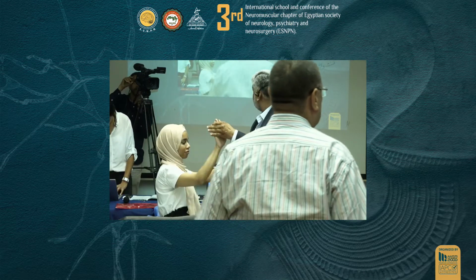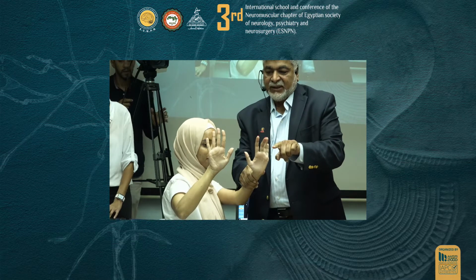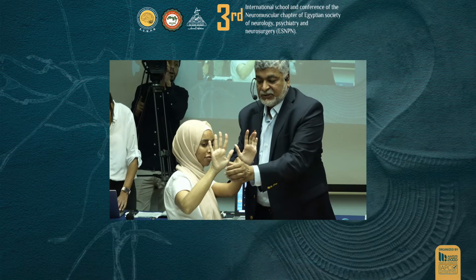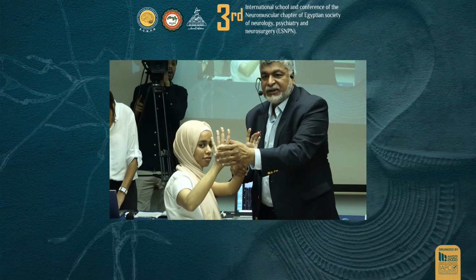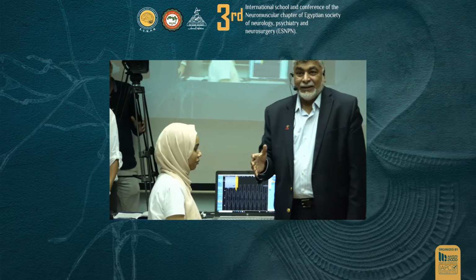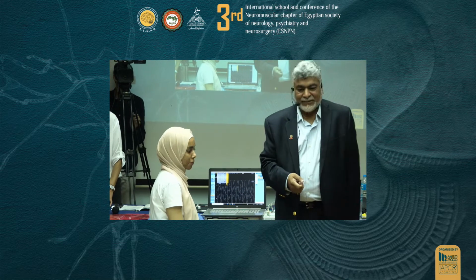Where's the camera? There? This one. So I'll hold this, okay? So you can see there's a finger drop over here. You see that? It's a bit flattened. This arm has got low muscle bulk. Trust me, the first dorsal interosseous muscle is thinner over here. And so this hand has got a little bit of atrophy and weakness. So it'll be a good example to see. Needle is very sensitive. It may pick up abnormalities on that side as well, but at least physically, no.